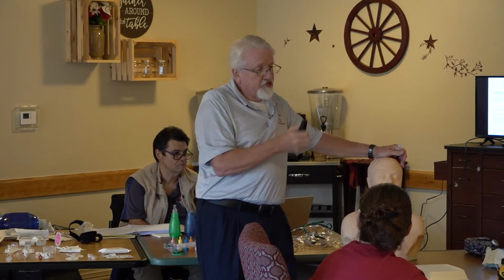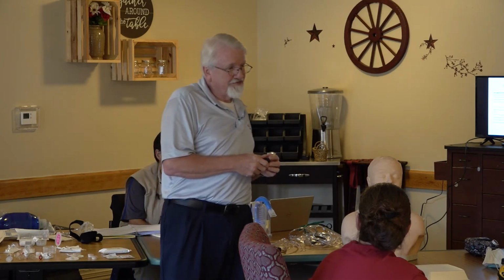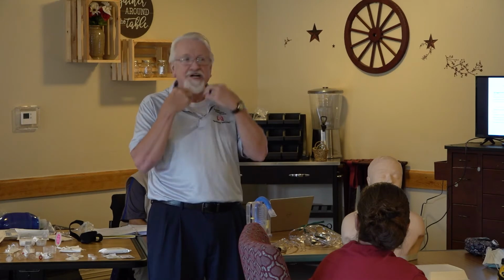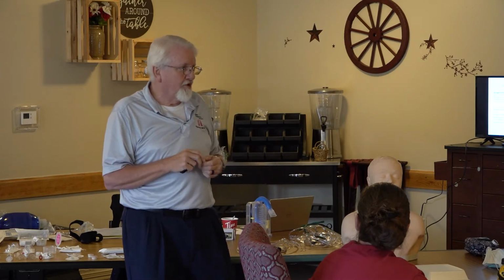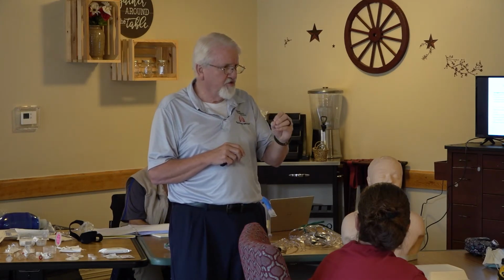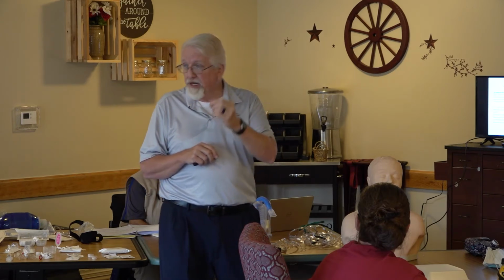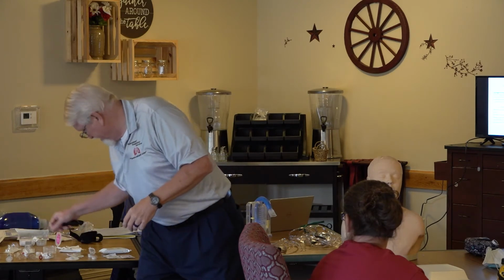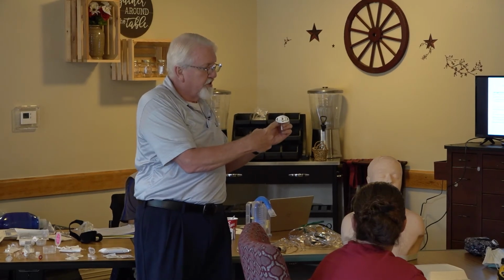It depends on what kind of a job the physician did that placed it. I've seen butcher jobs and have had to remove as many sutures from the stoma as I have had from the trach. But normally we're going to say there's going to be 0 to 2 sutures to the stoma area. Okay, and then the other sutures are going to be usually at the 4 corners.